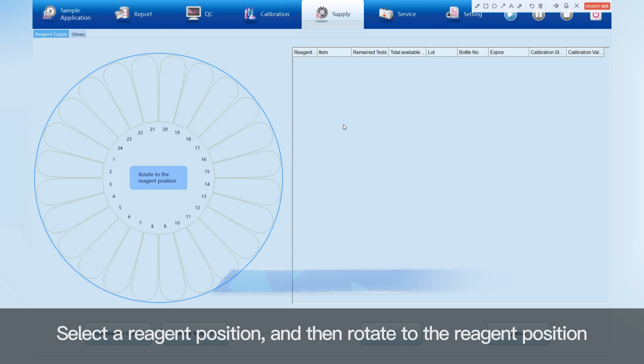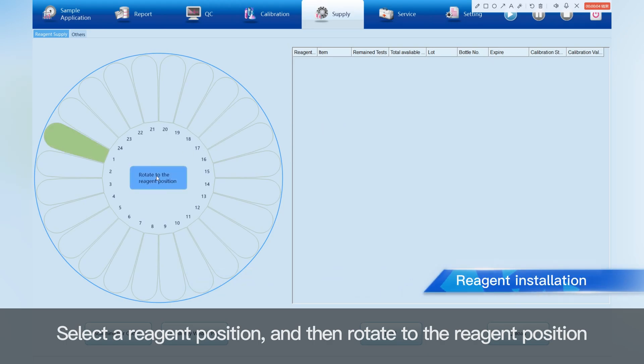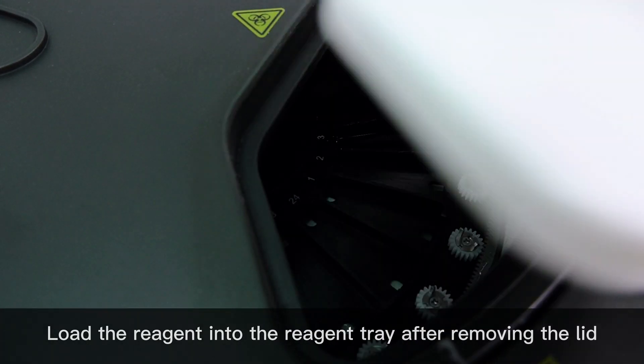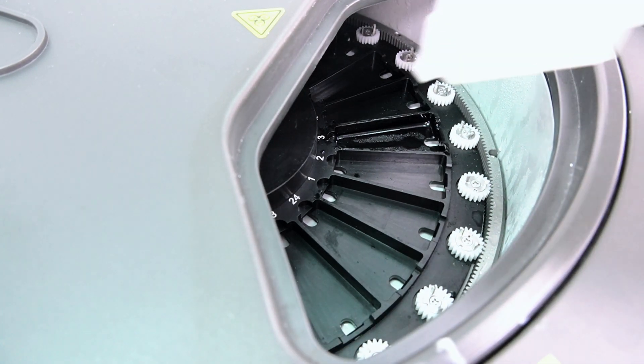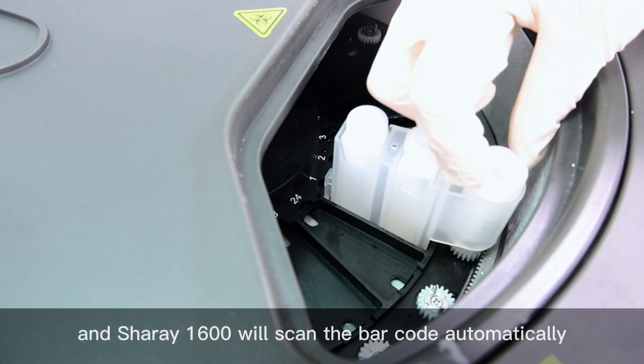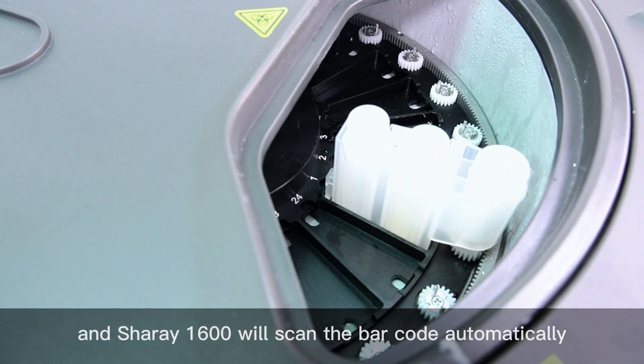Select reagent position and then rotate to the reagent position. Load the reagent into the reagent tray after removing the lid. The Sharay 1600 will scan the barcode automatically.